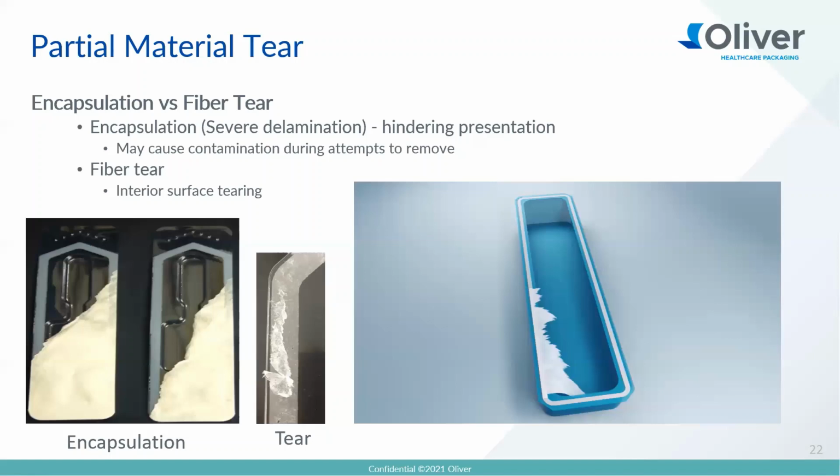And by the nature of a sterile barrier system, the interior surface should be sterile. So therefore, it doesn't matter if they extend into the interior, they should still be sterile. And so I'm not sure what the concern is at that point.